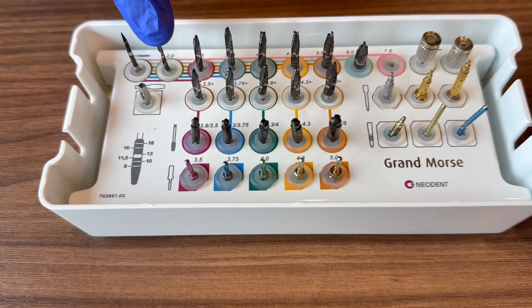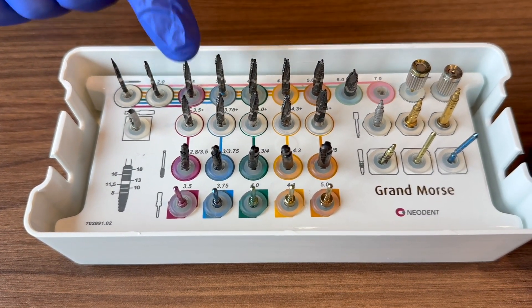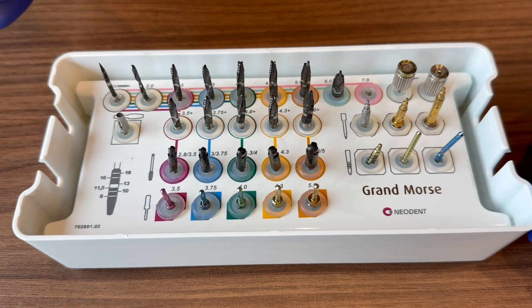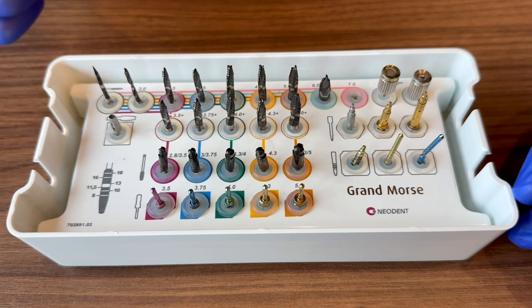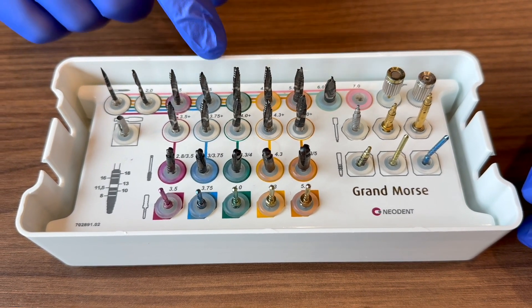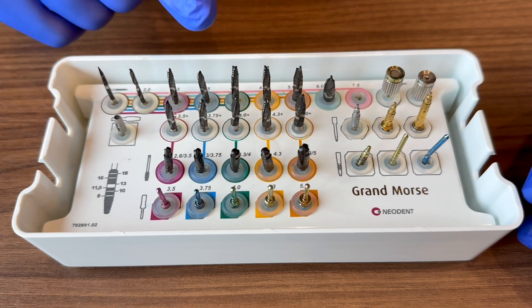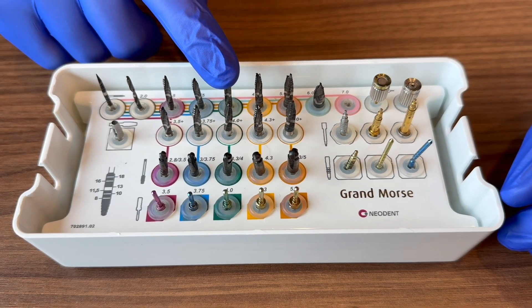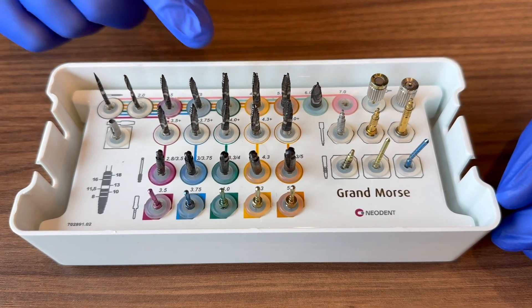For example, if you want to place a 4.0 by 10, you drill each step to 10 millimeters. In softer bone you might stop before the final 4.0 drill and request the implant. In normal or hard bone, go all the way to the 4.0 drill at 10 millimeters, then request your implant.